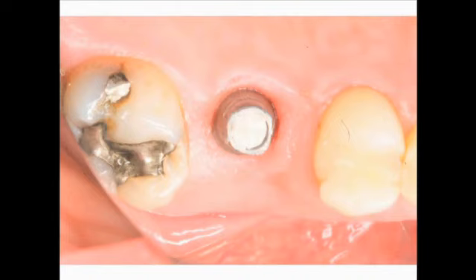A piece of cotton or silicone is placed into the screw hole after torquing to place, and a little Cavit is used to cover the screw hole prior to crown cementation. I always want to be able to get back to my implant itself if there's any problems. If there's problems with the crown, with porcelain chipping, contacts, or if there is any infection or problems around the implant, it's nice for me to be able to remove the crown, remove the abutment, and get back to the body of the implant if I need to.